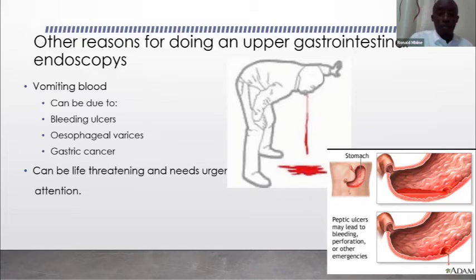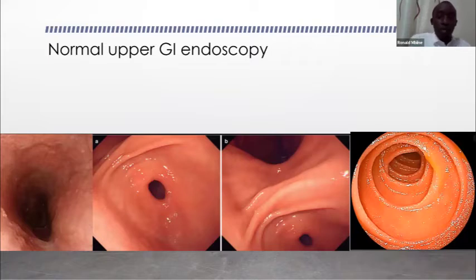Yeah, so we always recommend that if there is bleeding, and you see a primary care physician, they will actually request that you have an endoscopy. The causes of bleeding are quite a number, much as this presentation is not directed to go into those details. A normal endoscopy will look at the mouth, like I told you.